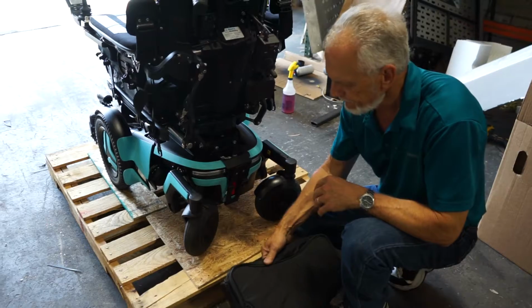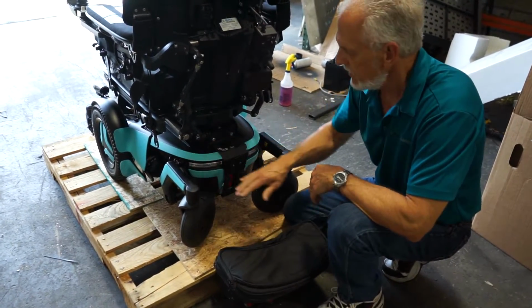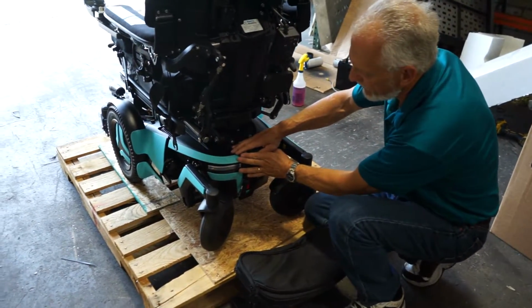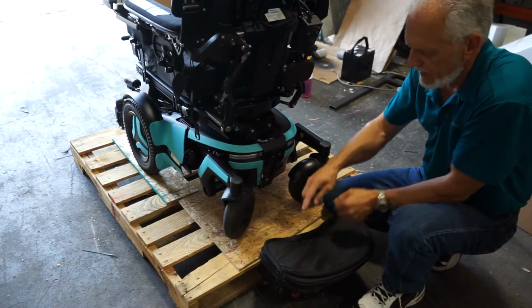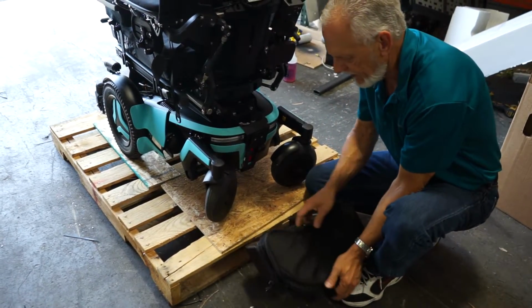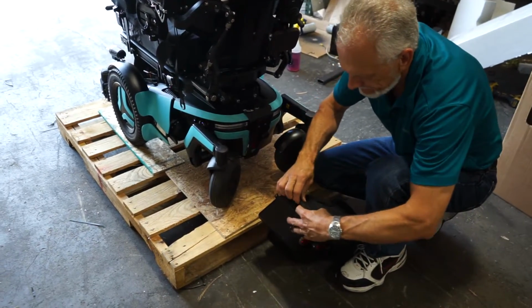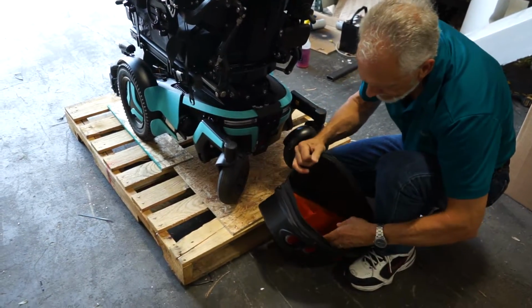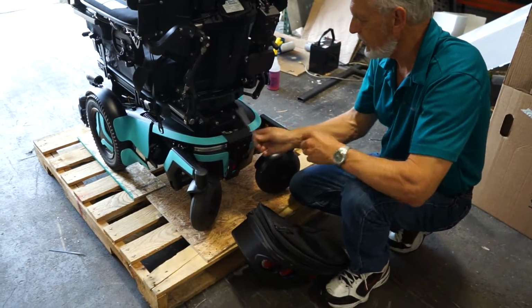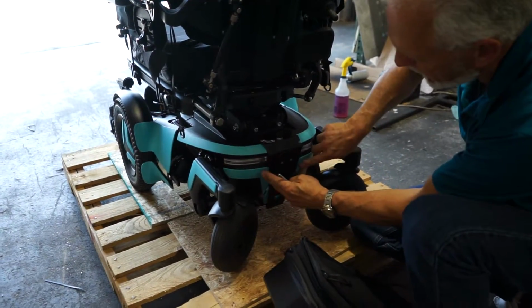Okay? Now, when I send you the color shroud, this is the blue here, to replace this little one right here, which just sits on Velcro, you're going to have to take this plate out right here, okay? This little plate. So inside the box right here, if I can figure out how to unzip something, there we go. Inside your box, I've included what you need to take these two bolts out, to take this little bracket off so you can replace the color, the blue here and the blue under here, okay?